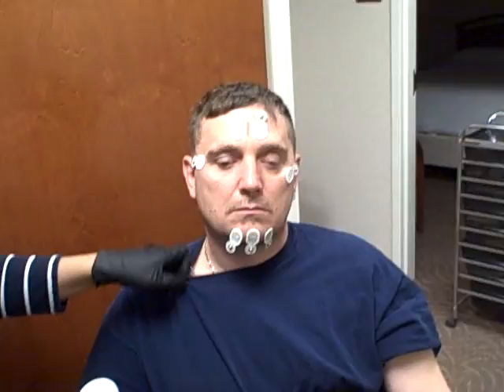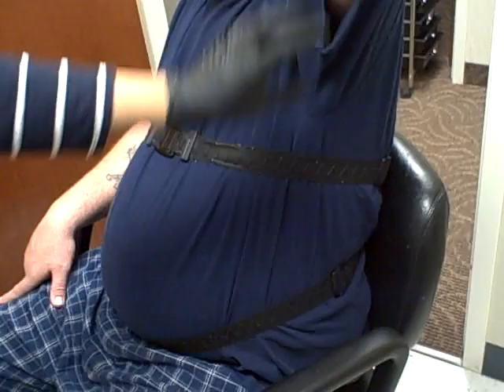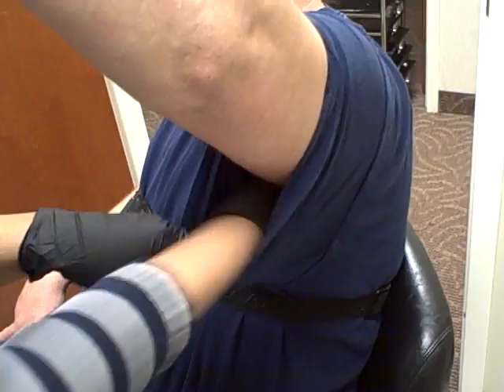And we attach our EKGs. This one here is for EKG2. Can you lift your arms, sir? And that's for our EKG1.